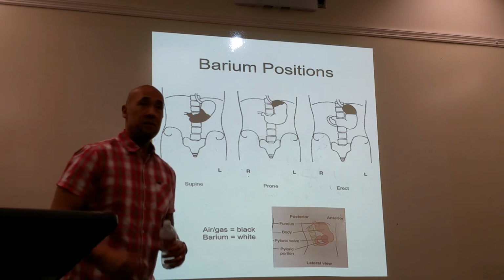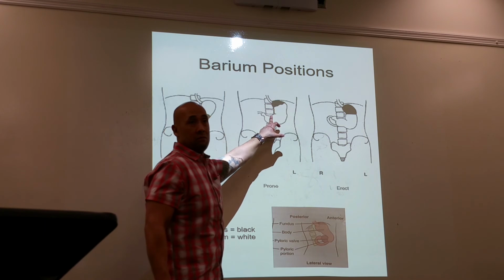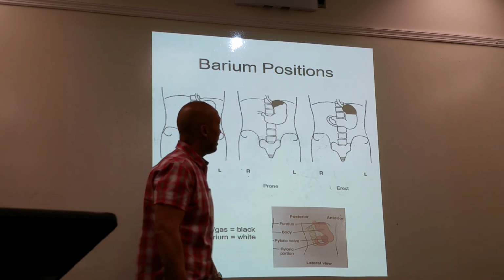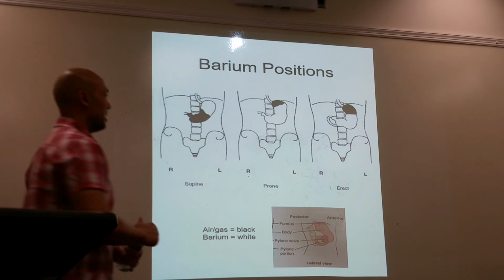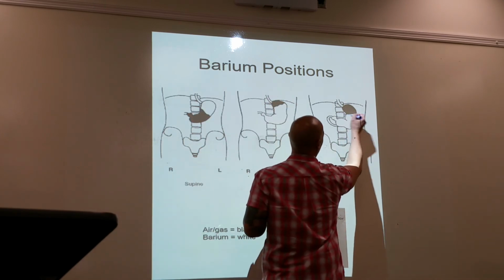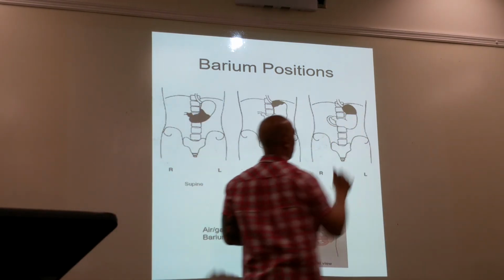So now if you're prone, you're face down, because the majority of the body and parts of the pyloric portion is anterior, that's where the barium is going to go now. You're laying flat, and now this is on the upside, so air is going to go towards the back. What's the difference between this one and this one? They kind of look alike, because it says here this is upright. You got the fluid level. This here is telling you this is the fluid level. Does that make sense? This is telling me the patient is in upright position.